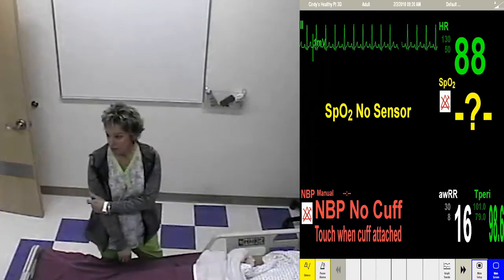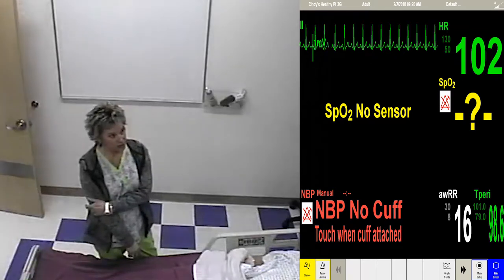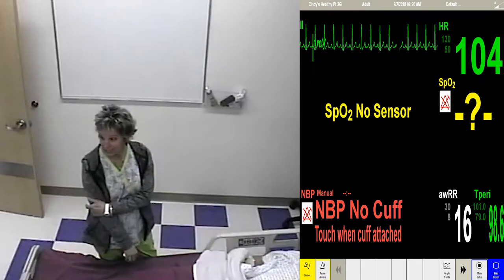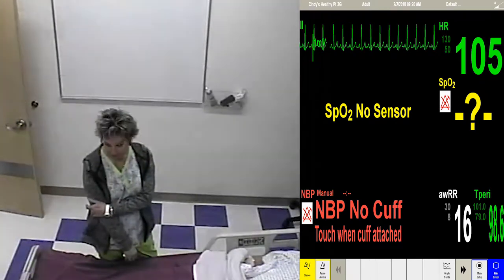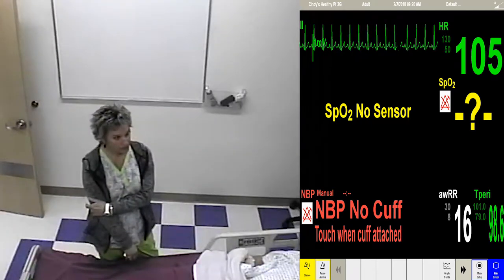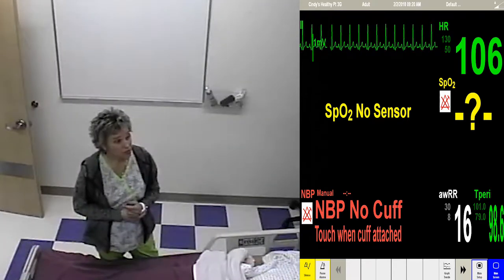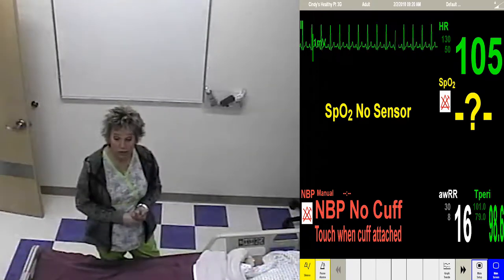Are there P waves? Yes. Are there QRS waves? Yes. Are there T waves? Yes. Is there a P before every QRS? Yes. Is there a T after every QRS? Yes. Bob your head. Is it regular? Yes. Could you answer yes to all those questions? Yes. So this rhythm is? Sinus.